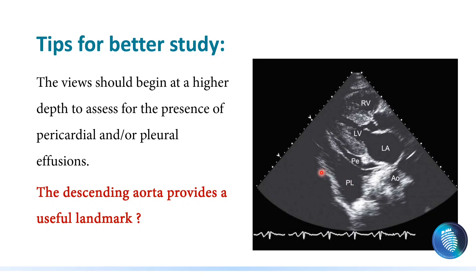How does the descending thoracic aorta — the structure just behind the left atrium — differentiate between pericardial and pleural effusion? The idea is simple: if the black fluid-filled space is in front of the descending thoracic aorta, just behind the left ventricle, this is pericardial effusion. If the fluid is beyond the descending thoracic aorta, this is definitely pleural effusion.